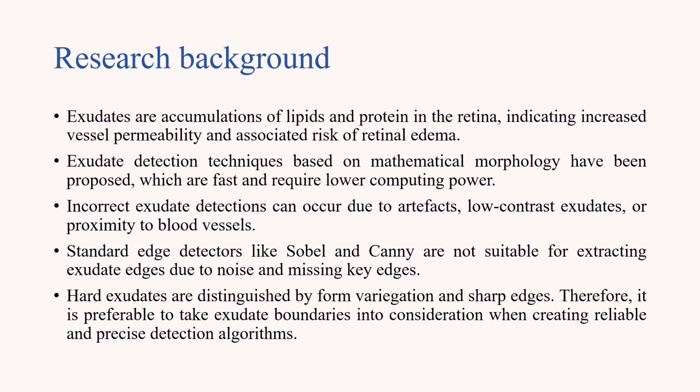Standard edge detectors like Sobel and Canny are not suitable for extracting exudate edges due to noise and missing the key edges. Hard exudate are distinguished by form variegation and sharp edges. Therefore, it is preferable to take exudate boundaries into consideration when creating reliable and precise detection algorithms.